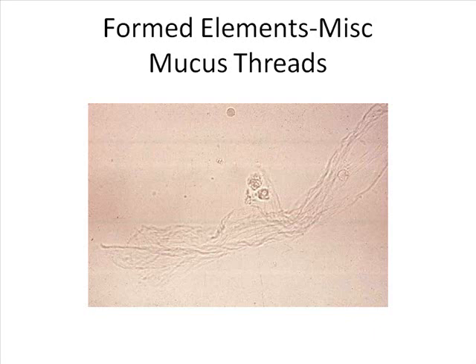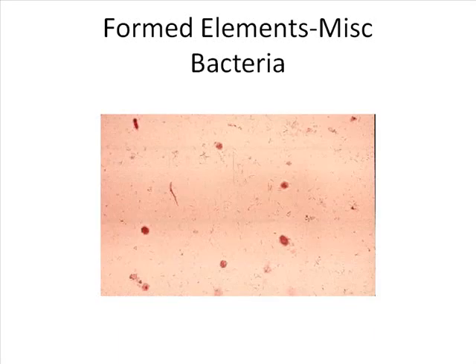If you have an infection, many patients with infections, when you go to look at the urine sediment, sometimes it almost looks like snot, and that is your response making more mucus, okay, to slough it off inside the ureter area and bladder.